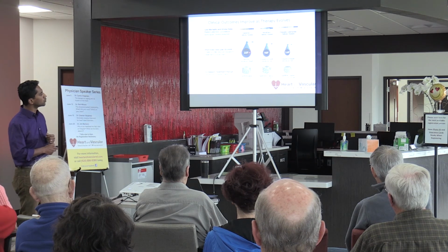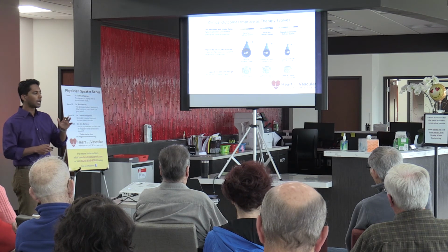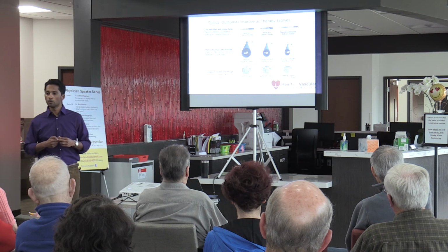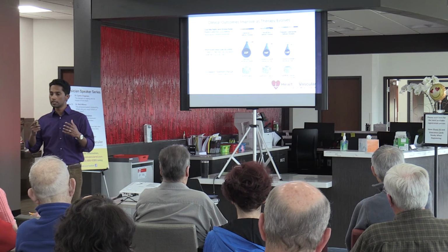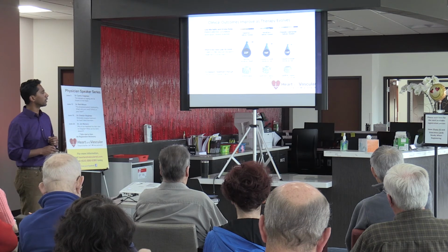And so this is what the tube was initially that had to go into the body to deliver the valve. And as you can see, it's gotten significantly smaller. And the valve itself has gone through 3 iterations, where they've improved on the design of the valve in multiple different ways to try and make it better.